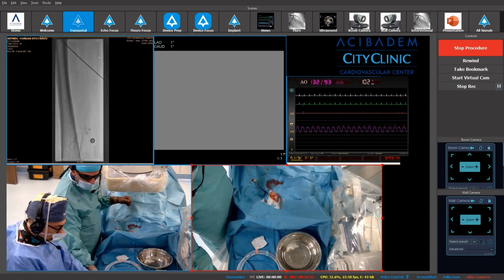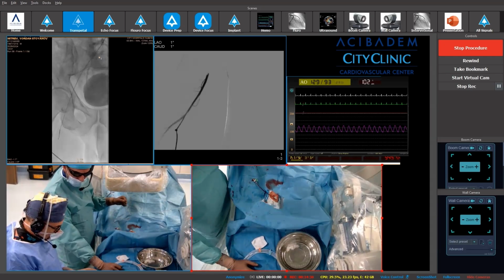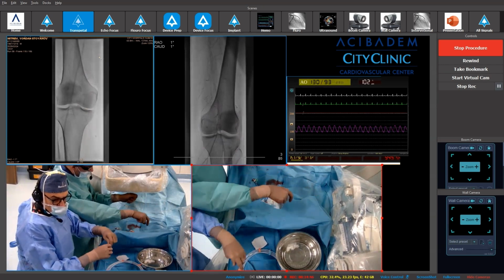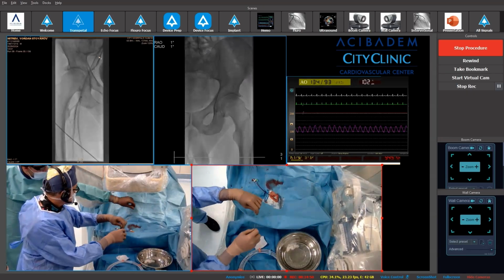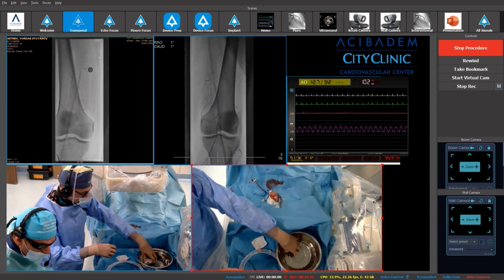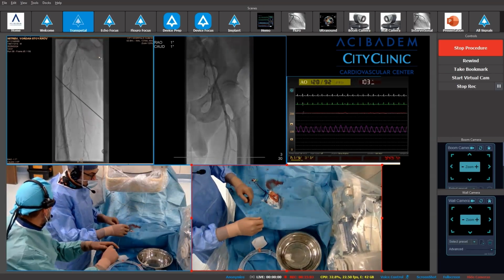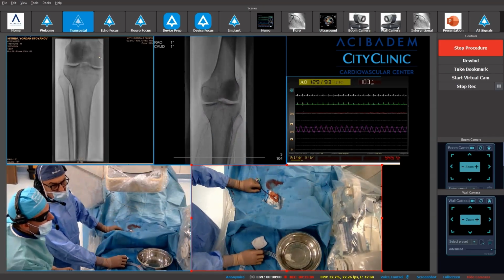This year, the percent of the tibial approach for peripheral artery disease of the superficial and popliteal artery is 33%, a huge percent compared with the previous year. Maybe we like this approach more and more, or the patient does. So we avoid femoral puncturing. If you have some comment, we are listening to you.